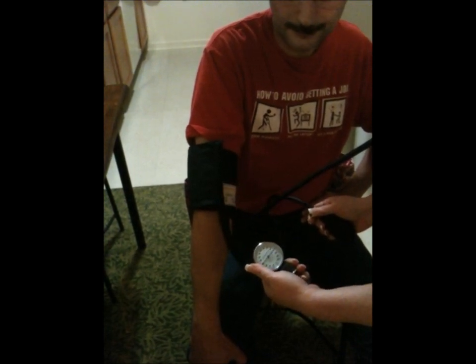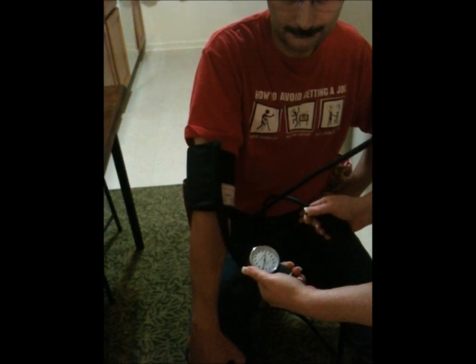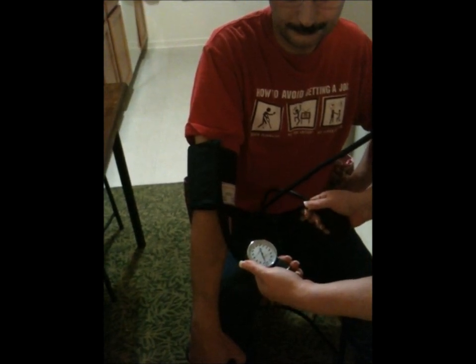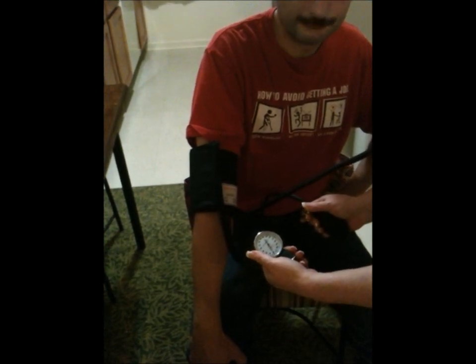The last sound of the heartbeat you hear will be the diastolic pressure. This man's pressure is 130 over 70, and that's how you take a blood pressure.